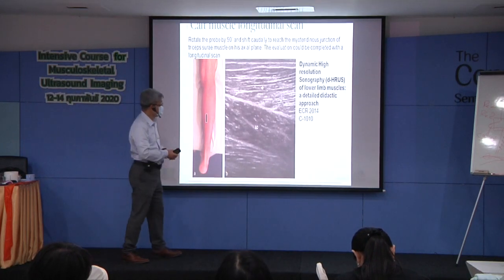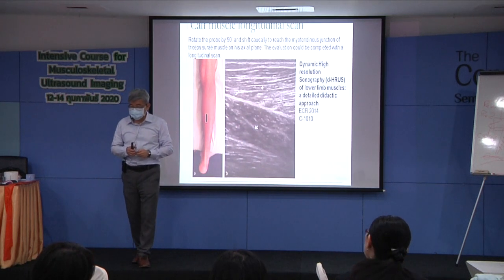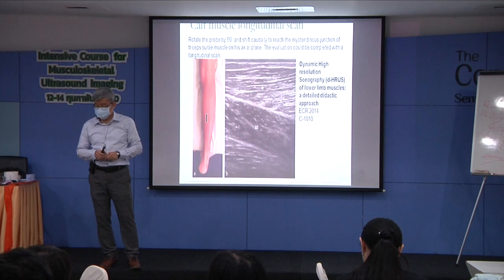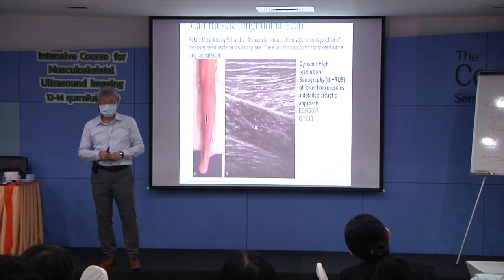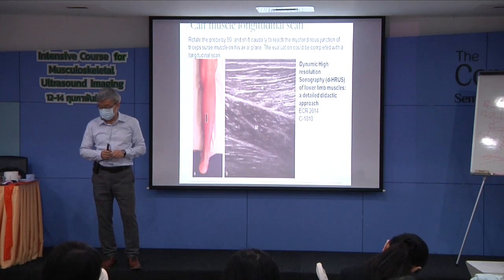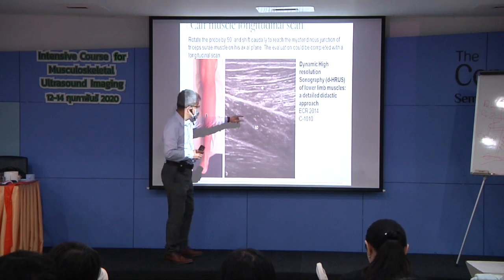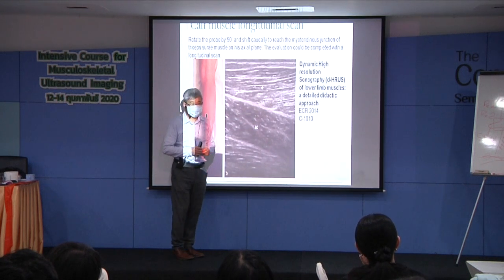This is the gastrocnemius and the soleus. A few years ago, a society in the UK, the Royal Society of Surgery, I think, a very high-ranking society, one of its editors wrote to me asking whether it is possible to use one window to look at the pennation angle in the gastrocnemius and the soleus at the same time.